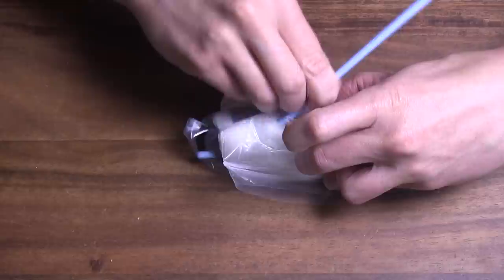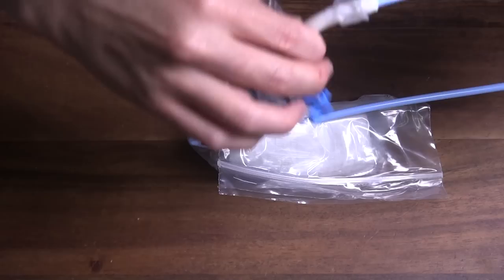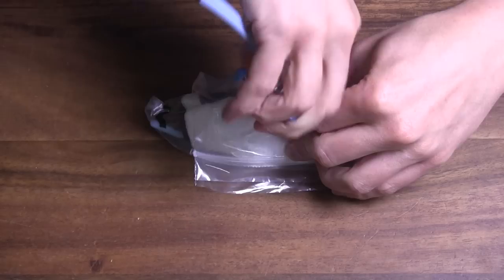I can get my finger out of there, and now I can re-grip, put on my cric, and wiggle it in until it reaches its endpoint. Bag, confirm with end tidal, secure, inflate, all is good in the world.